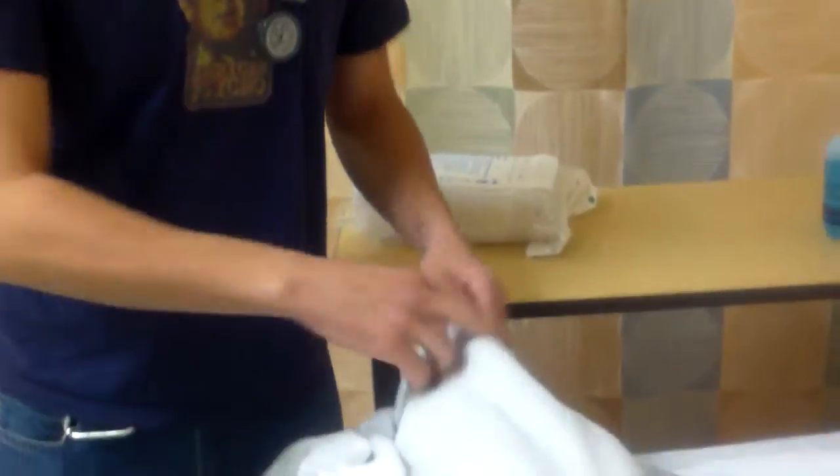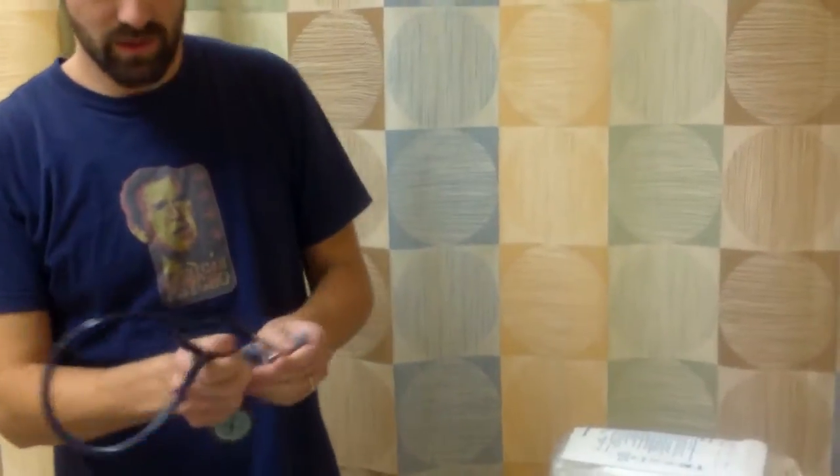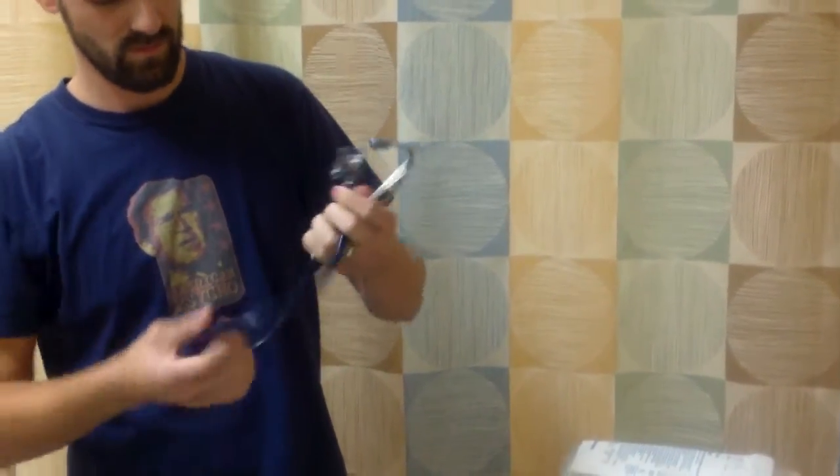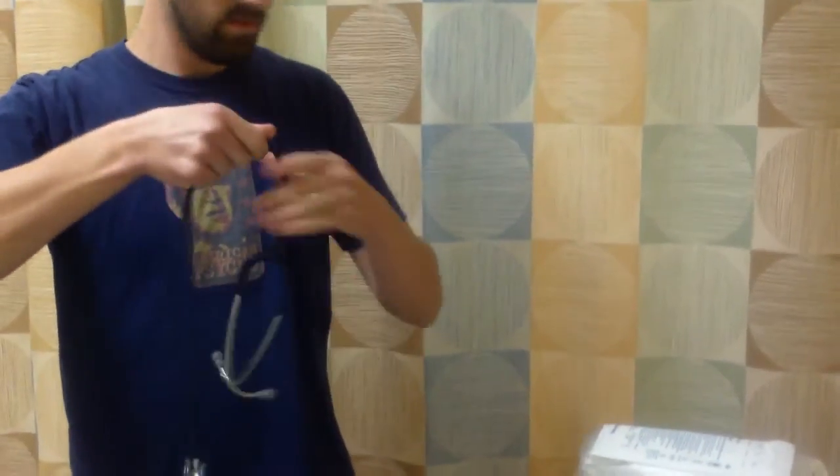The next thing I'm going to do is the abdominal assessment. I want to make sure I have clean equipment. So I'm going to sterilize, make sure my patient knows this. Make sure my equipment's all good. Get all that lubed up. Okay. So we have that. Next thing I'm going to do is an abdominal assessment.